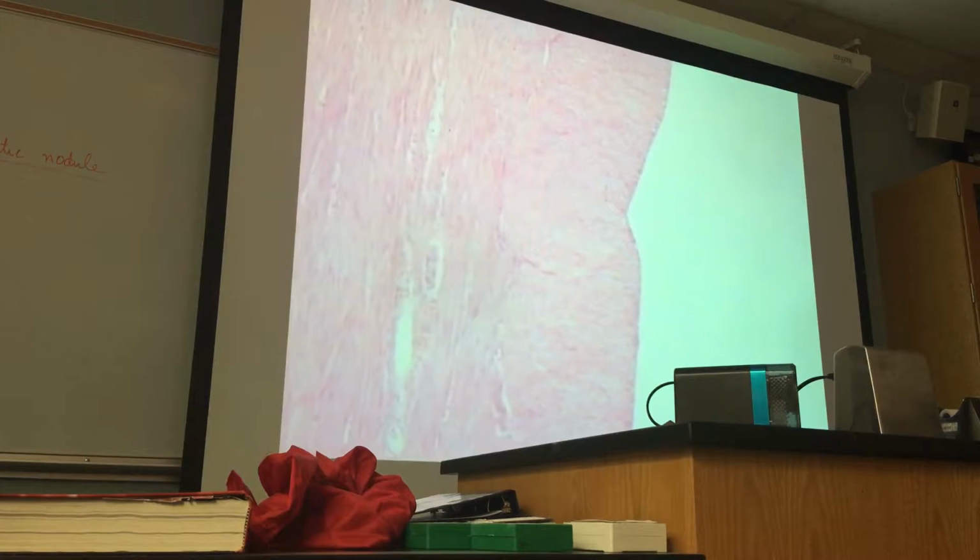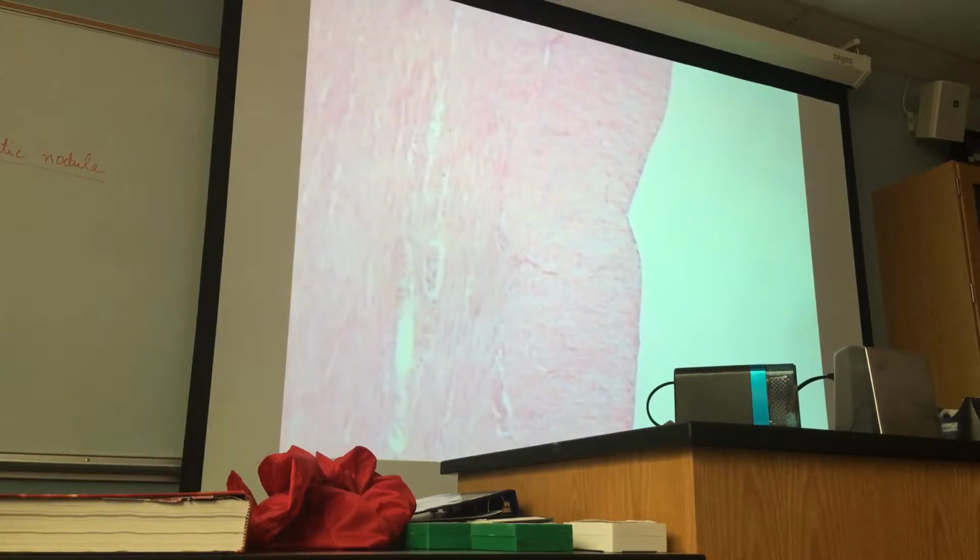All right. I'll take you to the serosa, and you see the dark line, but I bet you'll see the cells of the simple epithelium, simple squamous epithelium. Those are flat cells. So let me magnify. This is a little bit higher magnification, and you can see the nucleus or nuclei of the flat cells. Those darkly stained, can you see? And you will see better under even higher magnification.